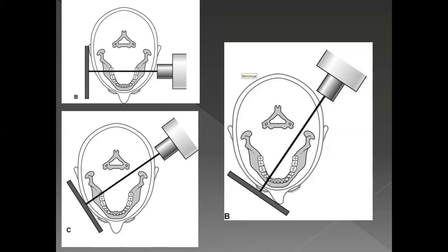Okay, we have a question over here. What about anterior teeth? Lateral obliques are not done for anteriors. Other than the canines, you can't really see the anterior teeth very clearly on this X-ray, all right? So you'll have to rely on periapicals or occlusal X-rays if you want to evaluate something in the anterior mandible, all right? So this is done basically up till the parasymphysis region somewhat, okay?